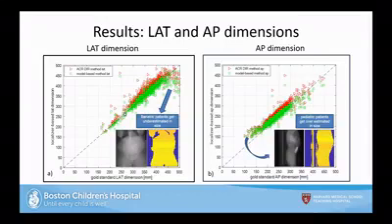We're continuing this project here, which I'm really happy about too, because it's specifically for the water equivalent diameter calculations. That's really what we should be looking at, but we want to make sure that everything that we have up until now is validated and works perfectly, obviously.